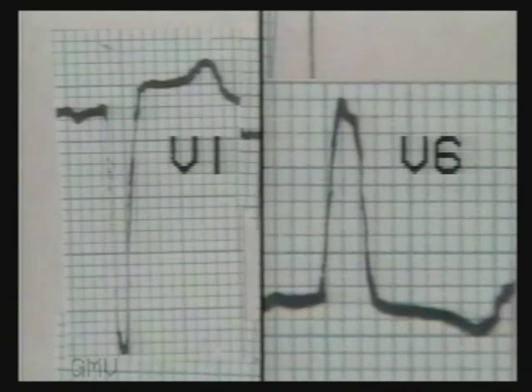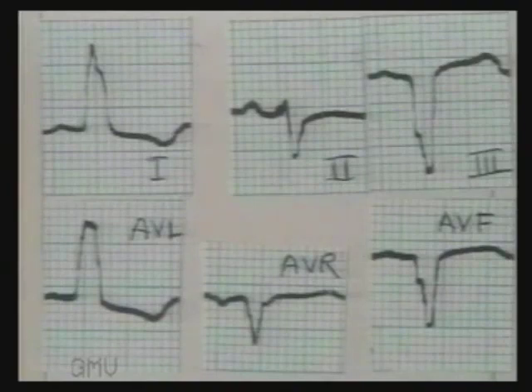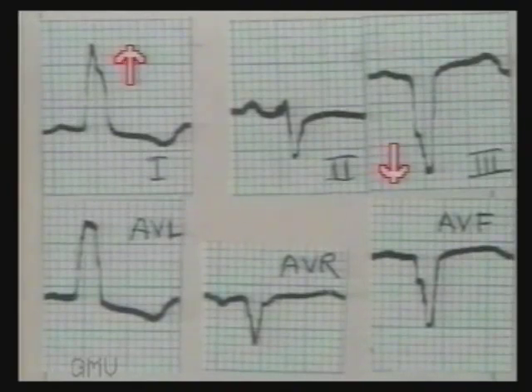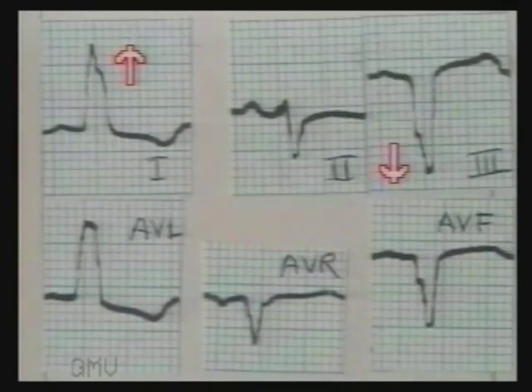Note that the T-waves are opposite in direction to the QRS complexes. Now let us see the limb leads — there is left axis deviation. The changes of left-sided leads V5 and V6 are also seen in leads I and AVL, which are basically left-sided leads.